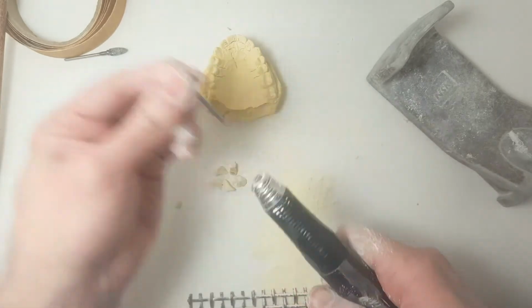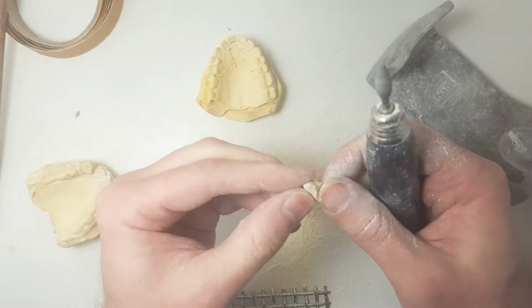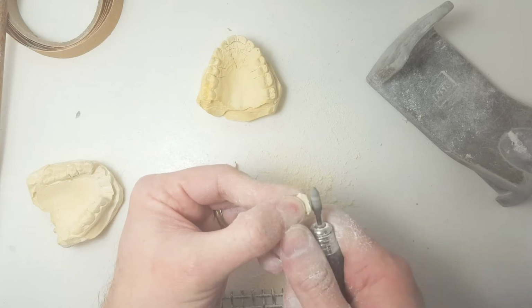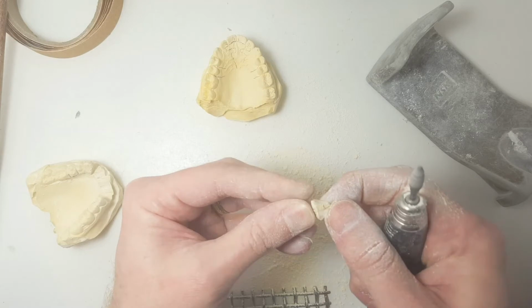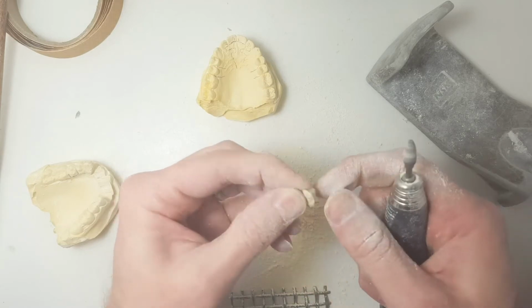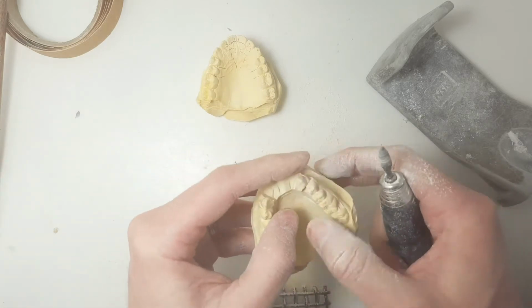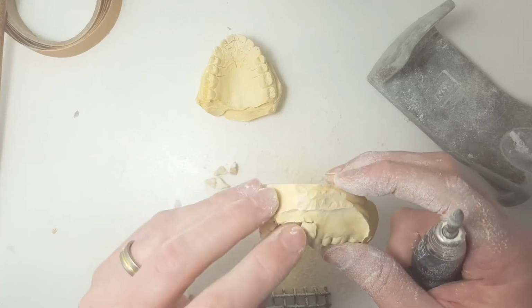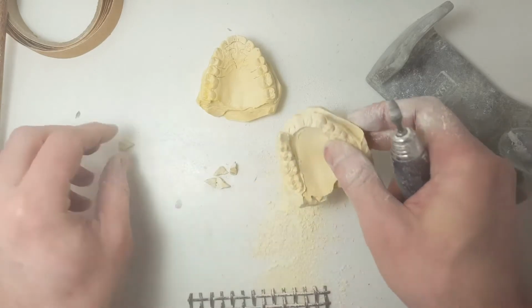Alright, so I'm going to taper these. Just get a regular burr here. And hopefully you can see my angle. I'm just holding at a certain angle. I don't want to touch the interproximal where the teeth touch each other, just the gums area. This will allow me to rotate it in the wax. So by tapering that, hopefully you can see this, I got a good space in there.